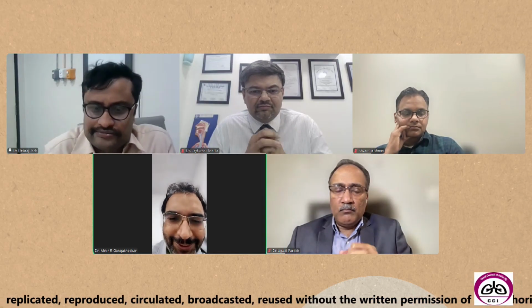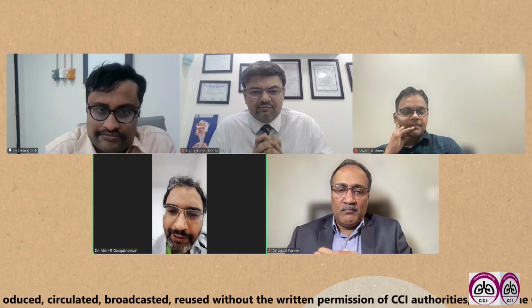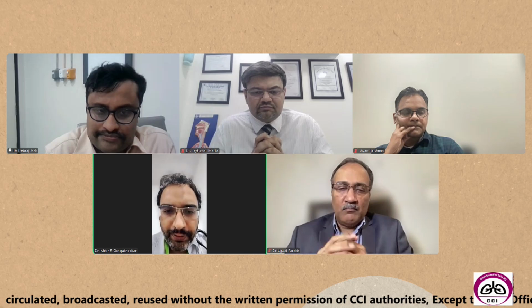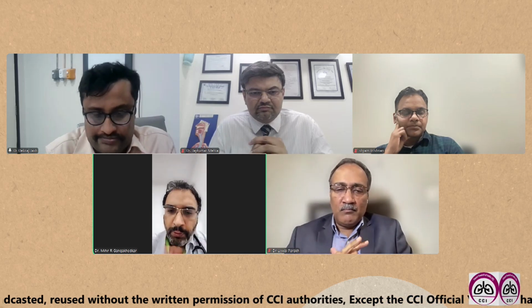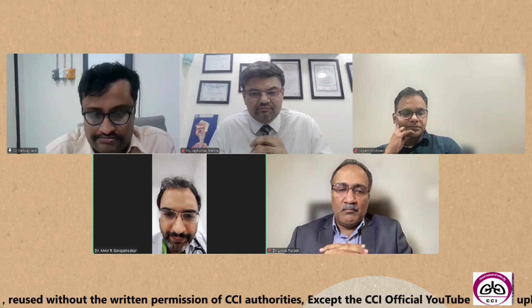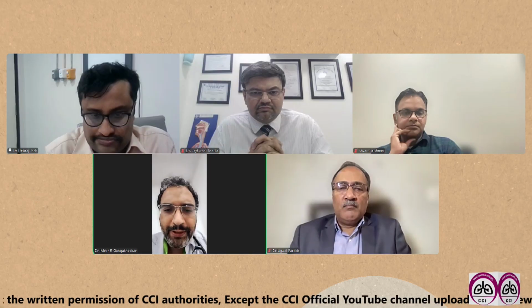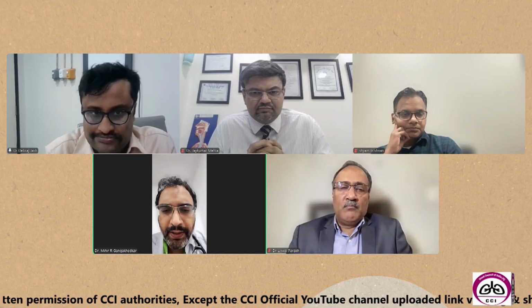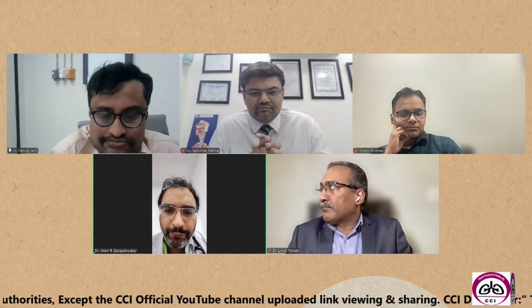Good evening, sir. As far as procedures are concerned, while we were training, we did a lot of these procedures on our own, which were bronchoscopist-mediated anesthesia, so it was primarily conscious sedation. We were using midazolam, and possibly some amount of fentanyl as required at that point of time.